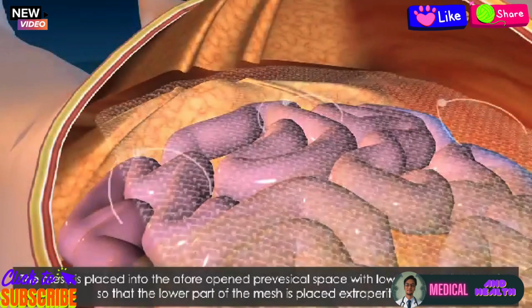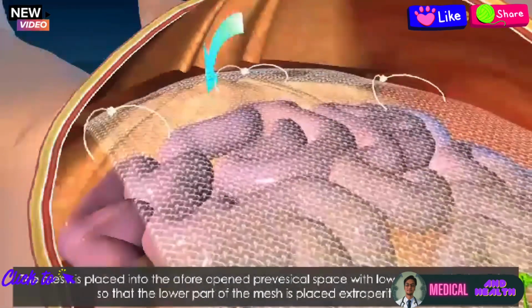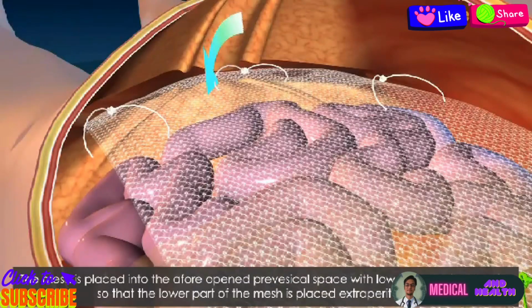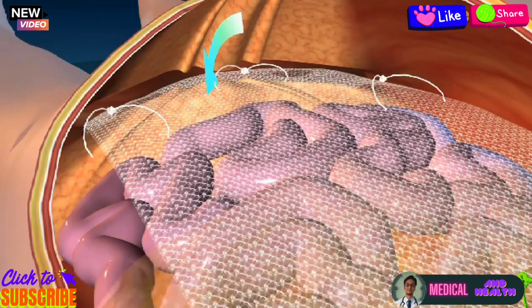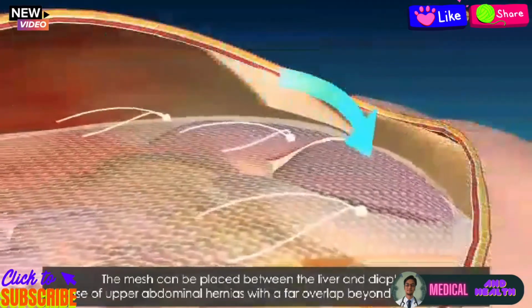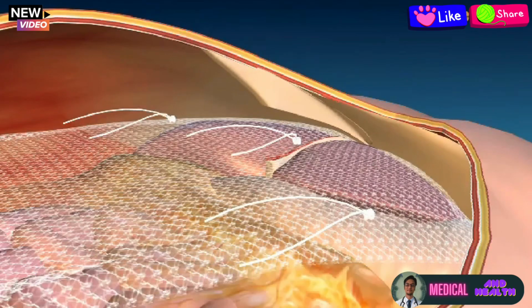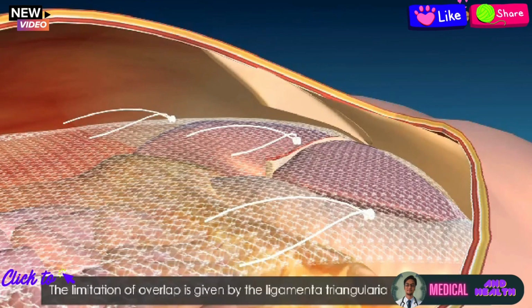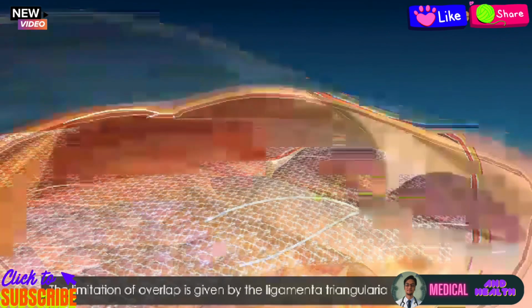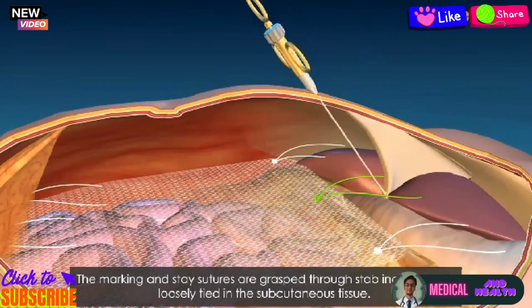The mesh is placed into the afore-opened prevesical space with lower abdominal hernias so that the lower part of the mesh is placed extraperitoneally. The mesh can be placed between the liver and diaphragm in case of upper abdominal hernias with a far overlap beyond the costal arch. The limitation of overlap is given by the ligamenta triangularia dextra et sinistra. The marking and stay sutures are grasped through stab incisions and loosely tied into the subcutaneous tissue.